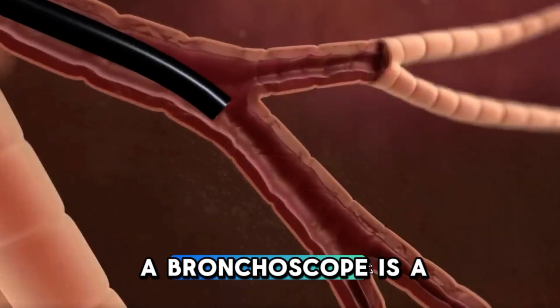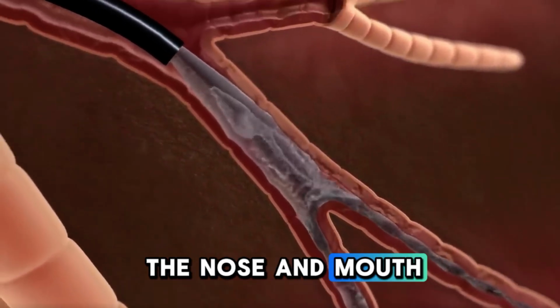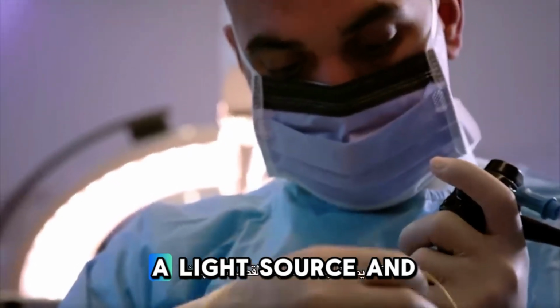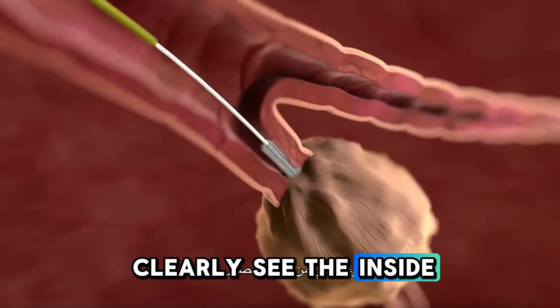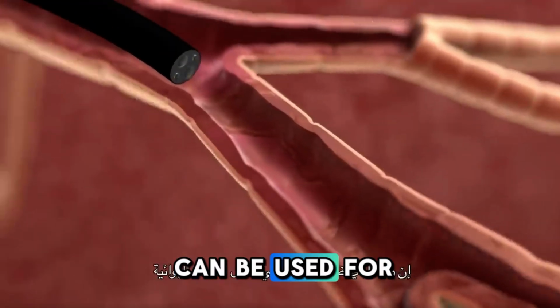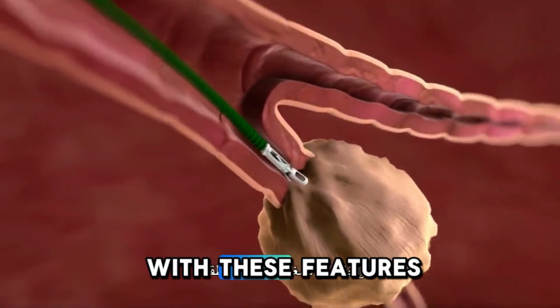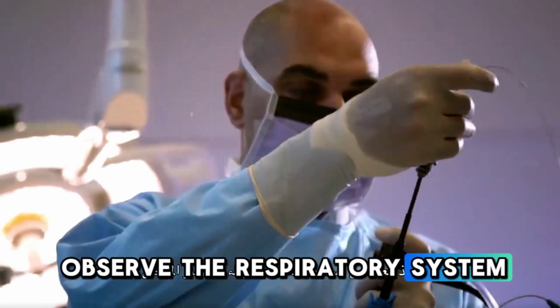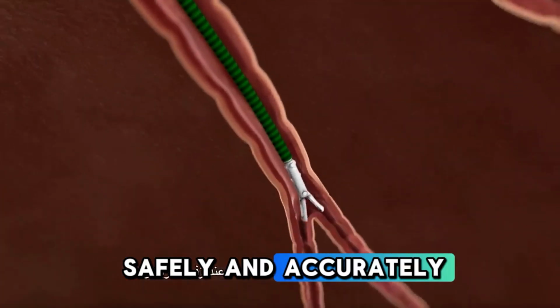A bronchoscope is a thin and flexible tube that is inserted through the nose or mouth and guided into the lungs. It is equipped with a light source and a camera, which allow doctors to clearly see the inside of the airways. In addition, it has a special channel that can be used for suction or to pass small surgical instruments. With these features, doctors are able to observe the respiratory system in real time and carry out procedures safely and accurately.